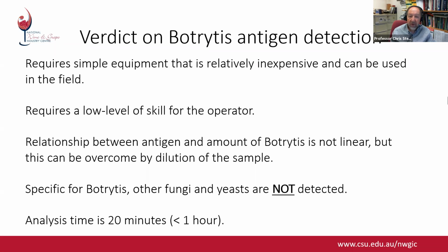The disadvantage is the relationship between the antigen and the botrytis is not completely linear, but maybe this could be overcome by diluting the sample. But the good thing here, two positives about this technique compared to the others, is that it's very specific for botrytis. Other fungi, yeasts will not be picked up. And the analysis time is about 20 minutes.